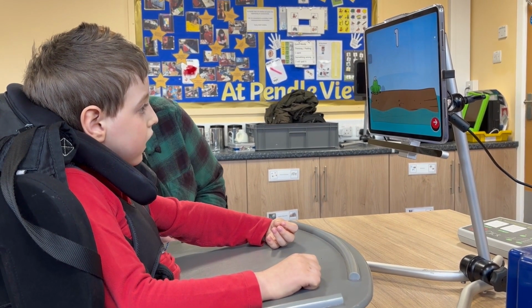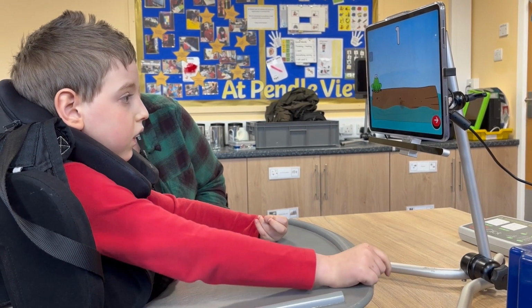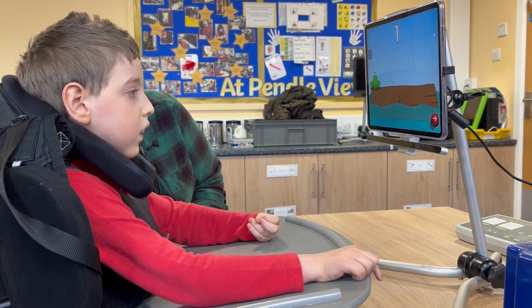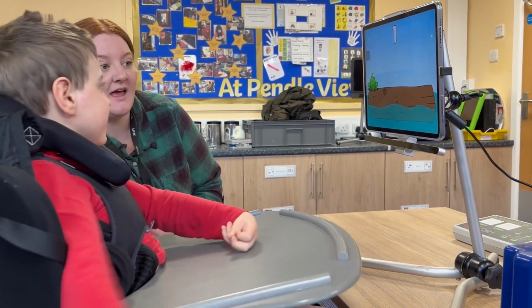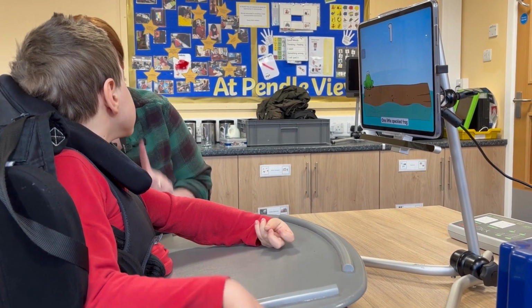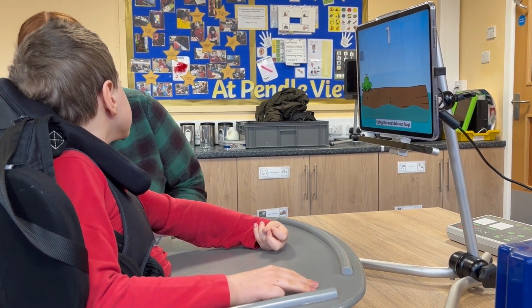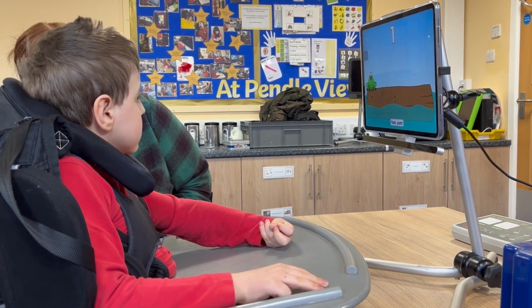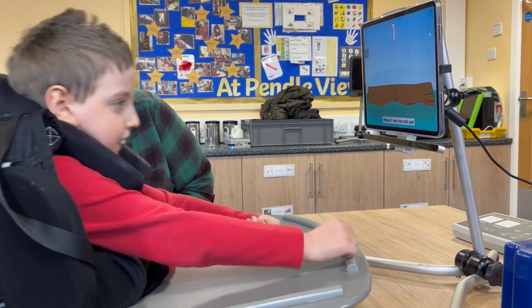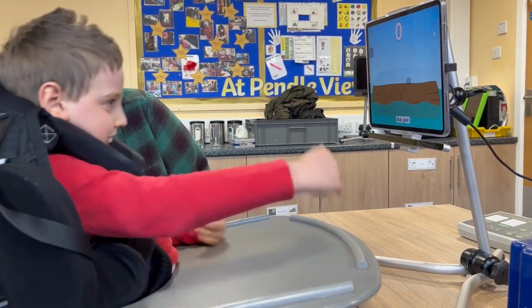So the interesting thing is, Harry also knows to move the screen on. He can go to the bottom right of the screen and hit that directional arrow, which he does with his eye gaze, which is really great. You can see, "One little speckled frog sat on a speckled log, eating the most delicious bugs. Yum, yum. One jumped into the pool where it was nice and cool. Now there are no green speckled frogs."